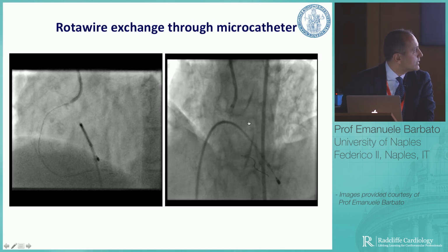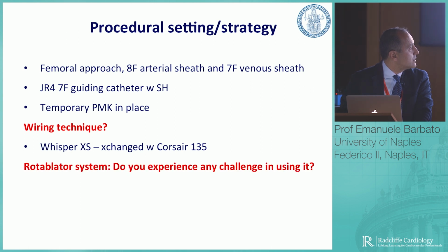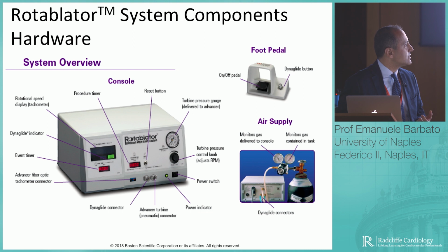Okay, I spare you these images. Okay, good. This is what we are used to. This is what we have worked with for many years. The dinosaur, we can call it. Now it is called by Boston the legacy. Can you imagine? So what has changed now in the RotaPro as compared to the legacy system?